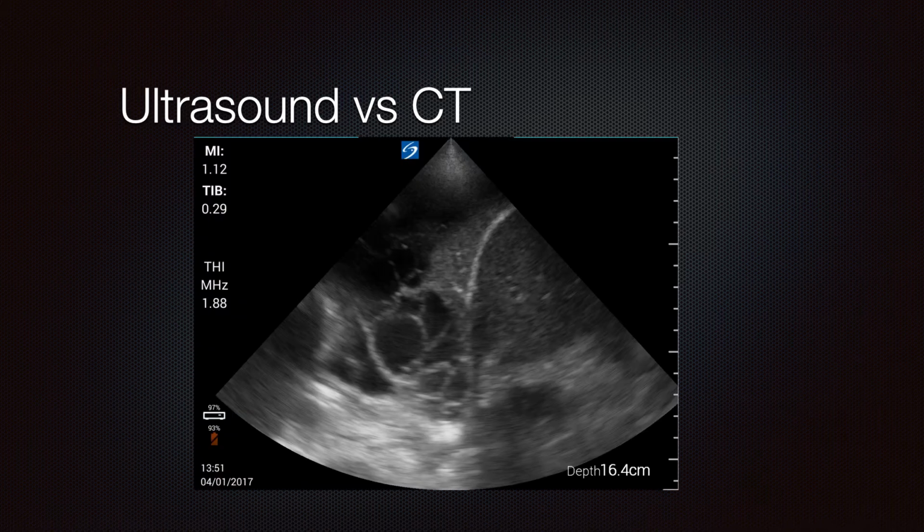So how is that clinically important? When you're looking at a pleural effusion like this, you can see tiny little septations or bubbles of air that markedly change your diagnosis. For instance, this would not be a transudative effusion with a look like this.